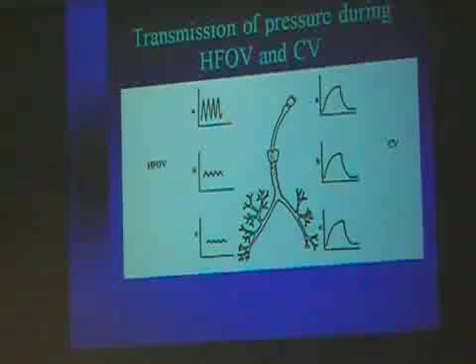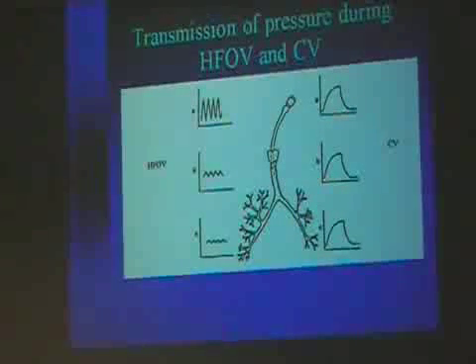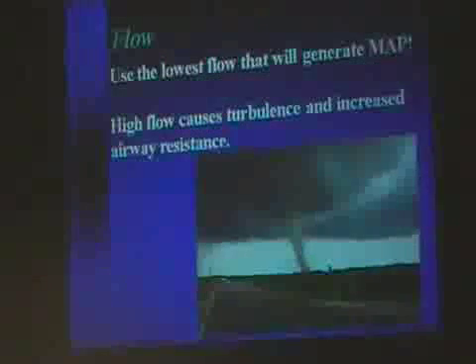So you can see that the tidal volume is way less, all right, which is one of the advantages of high-frequency ventilation. One of the great advantages, provided that you can use it appropriately with an adequate mean airway pressure and a small tidal volume. And remember that your tidal volume is going to affect your ventilation more than frequency.